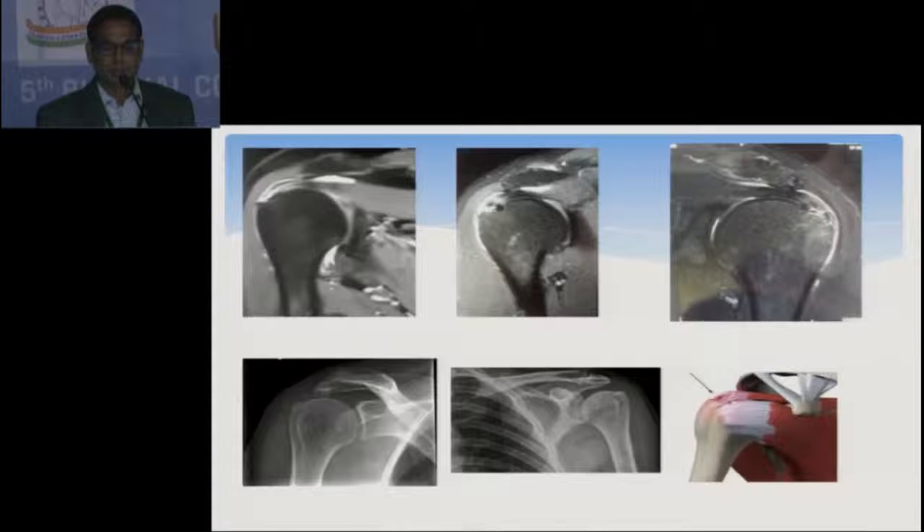Here you can see the bursal side tears, the sharp acromial spurs, and in some cases there is AC joint arthritis also.